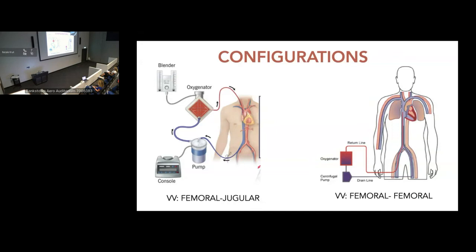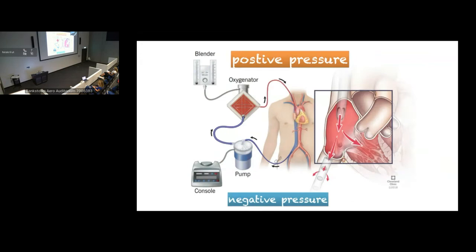So you can see the blue line is your venous access line. That's the drainage line, the access line, the negative pressure side of the pump. That drains blood under negative pressure into the pump. Now, we have no access ports on this side of the pump because if a tap were to come loose, you would get an air embolism or entrain air and stop the pump. Blood is then sucked into the pump, so it's a centrifugal pump, and then it pushes blood out under pressure.